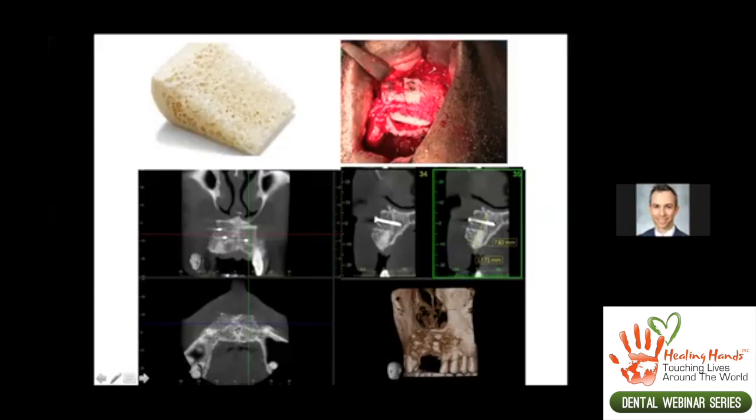And again, in these cases, full arch restoration, you have to think about the smile line, the lip line. You have to think about vertical clearance for the final prosthesis, and where the implants should be vertically for these patients. This is an example of a case where I also built up the palatal bone. This was probably a little bit excessive, but the patient had a very thin ridge with inadequate palatal shelf and buccal plate, and he also needed a sinus lift with augmentation of the bone coming out of the sinus in a guided tissue regeneration fashion.